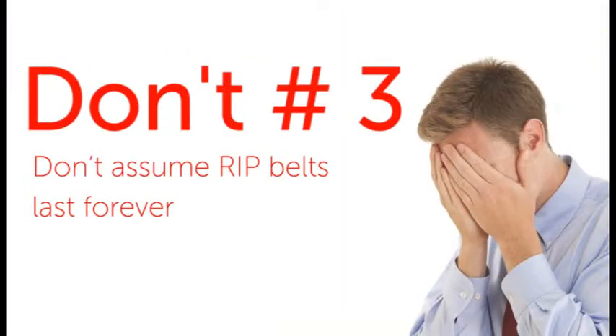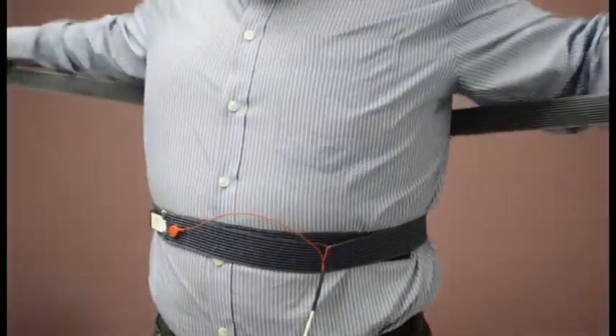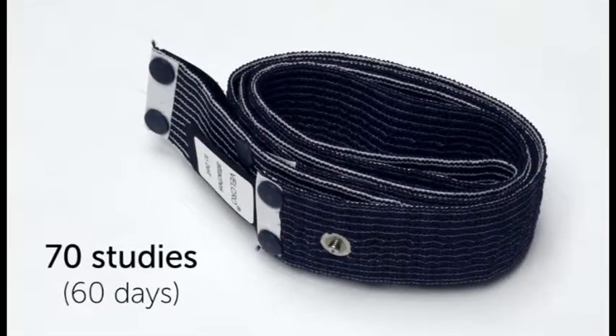Don't number three: don't assume RIP belts last forever. RIP belts are semi-reusable and are not meant for long-term use. Belts are guaranteed for a normal use of about 70 studies for 60 days. A RIP belt that produces no signal data in BioCapture will need to be replaced.